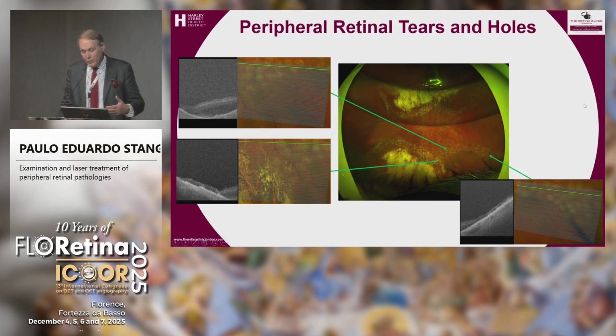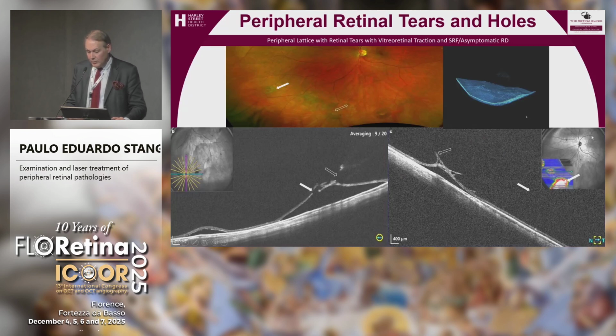This is a patient where I did surgery. Surgery didn't work, had 2 vitrectomies, and an edge still opened up, and I created a barrage of laser. There's still gas in the eye, but you can see here on the reflection how I've managed to laser up to the ora, because that's where it's important. It's important to create a barrage up to the ora. But the only way to reach that area was with the indirect ophthalmoscope. So if you don't do indirect ophthalmoscopy, you're really limiting yourself.